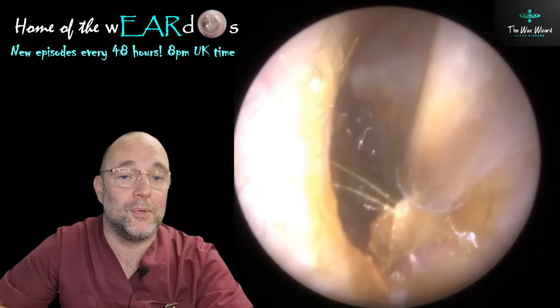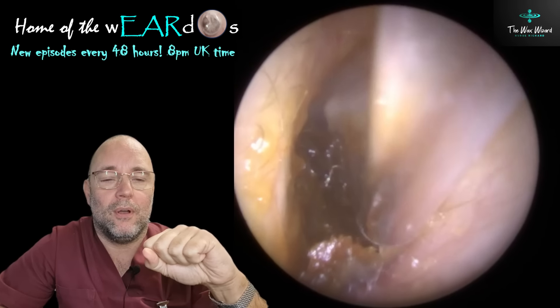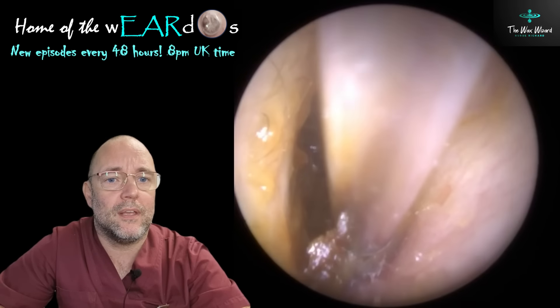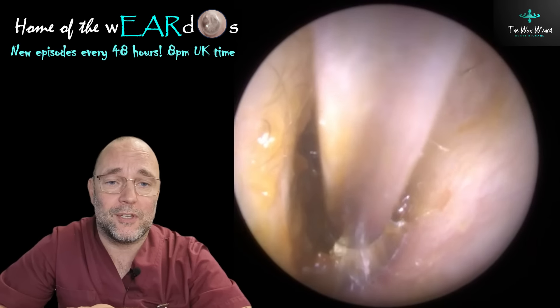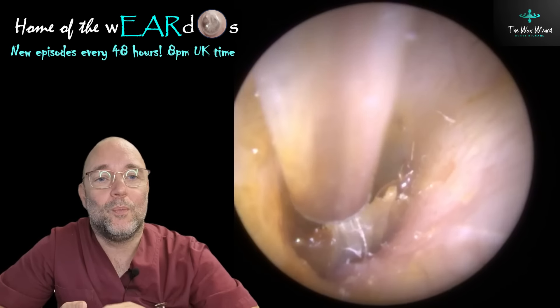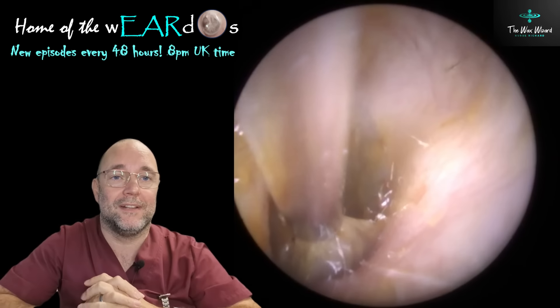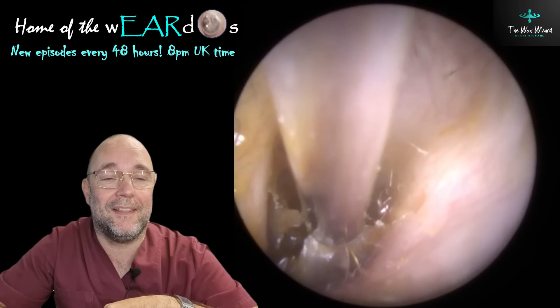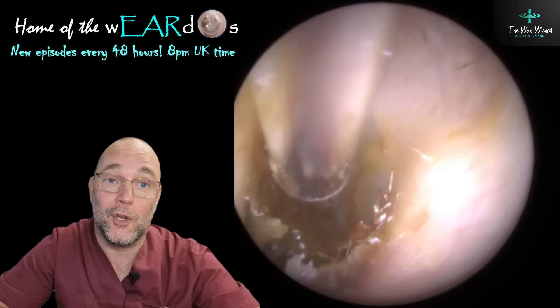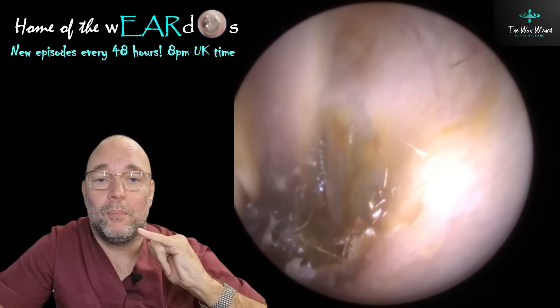Now, this wasn't a cotton bud. This lady had shoved a little finger in there, right like that. I was thinking in my head — are you sure? — because it's gone right down onto the eardrum. How on earth did you manage to shove that in there so deep, because the ear canal's not very big at all. Most people, if you push your finger in there — I'm not saying try it, please don't — won't be able to fit their finger in there. I really can't get mine in. Then she showed me her hands. She was quite a petite lady and her fingers were absolutely tiny, like two little toothpicks. So I thought, okay, I believe you — I imagine that's what you have done. She did it in this one, not in the other one, as you can see the difference between this one as opposed to the other. Still takes some doing — it's just one poke, that's all it took.